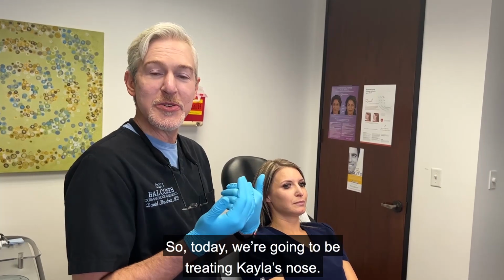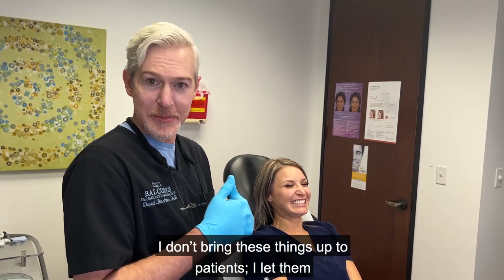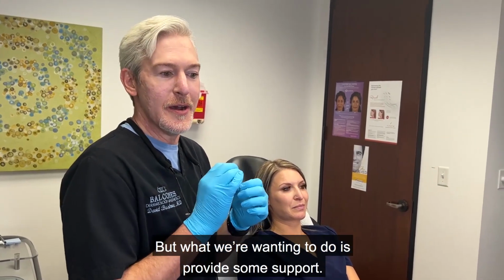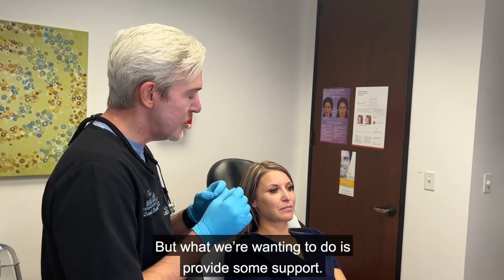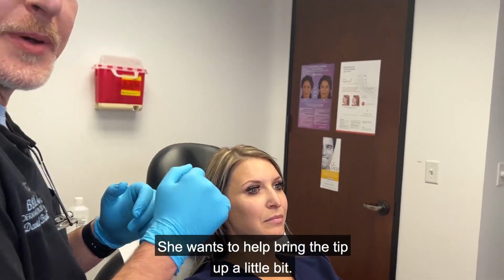So today we're going to be treating Kayla's nose, and this was brought up by her. I don't bring these things up to patients. I let them make the suggestions of things they want to treat. But what we're wanting to do is provide some support. She wants to help bring the tip up a little bit.